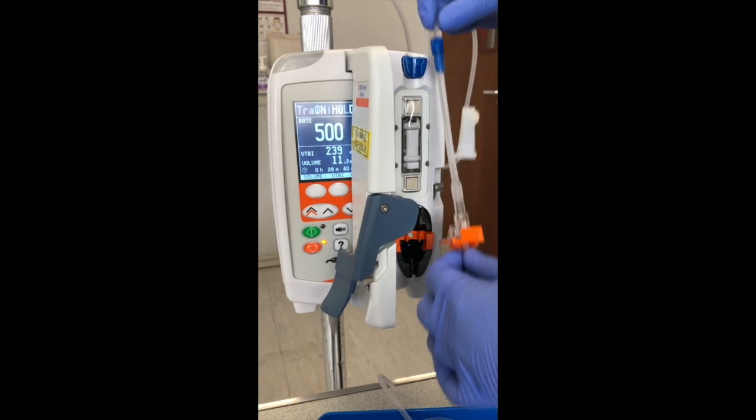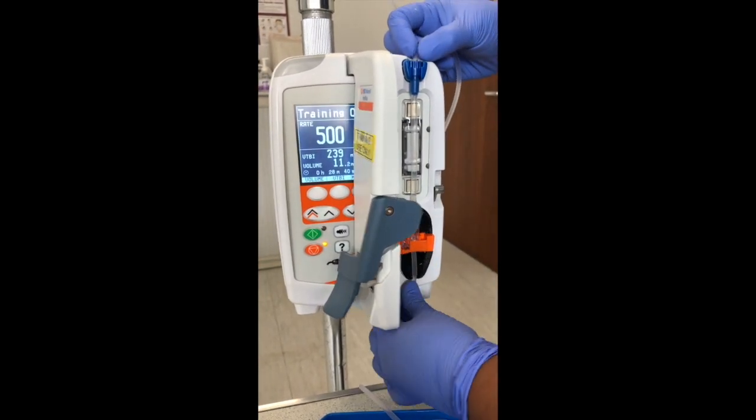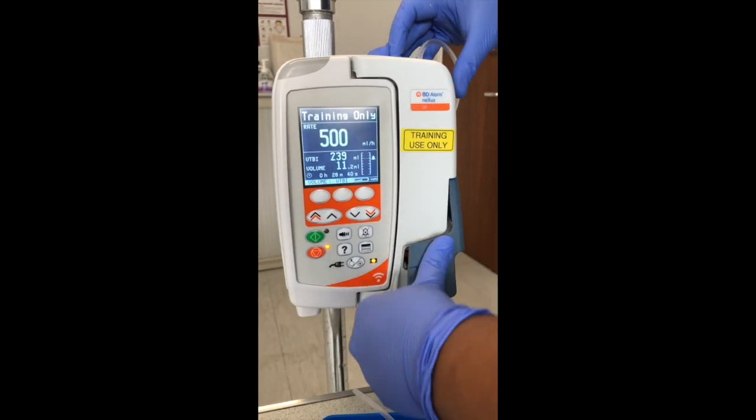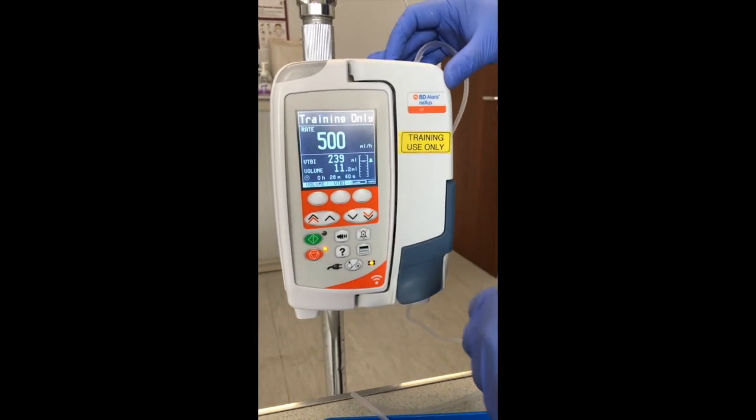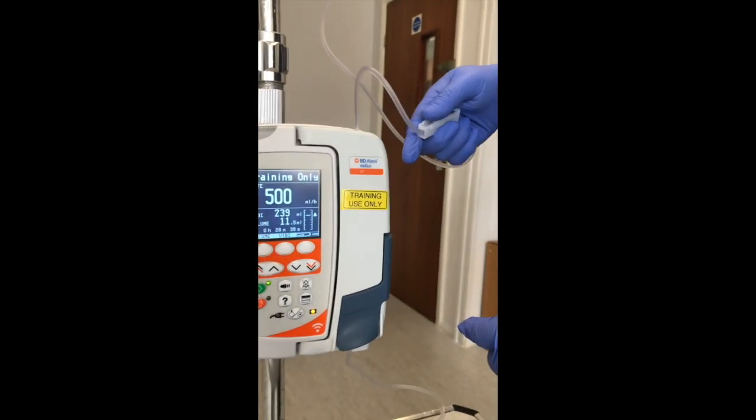Once you've gotten rid of the air, put your line back in, blue on blue, orange in orange. Ensure that there's no kinks in the line and close. Attach back to your patient and start your pump. Ensure that your roller clamp is now open.